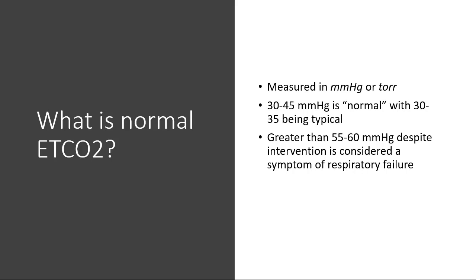Now, there are some other things that can cause this, including malignant hyperthermia and other conditions, but none of them are good. And if you think 55 isn't that much higher than 45, we're okay, no, that's a huge red flag. All right.